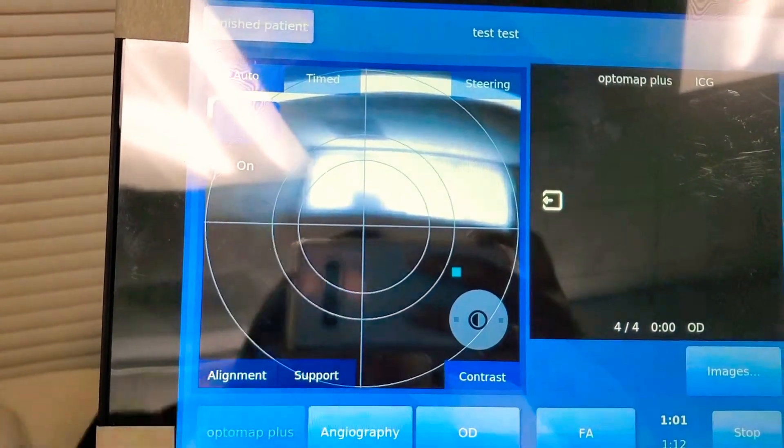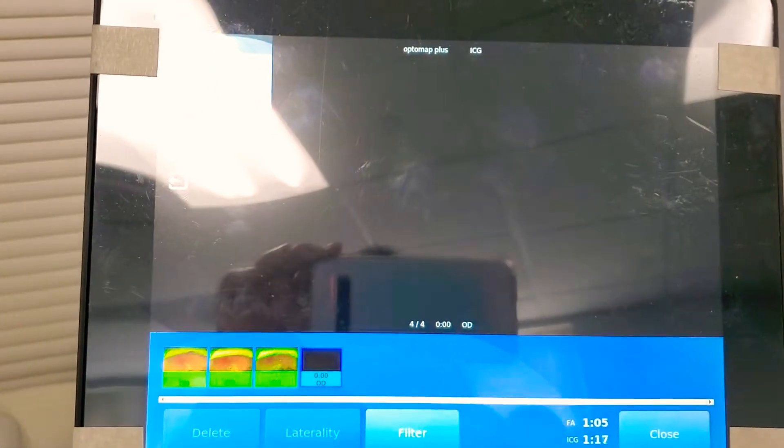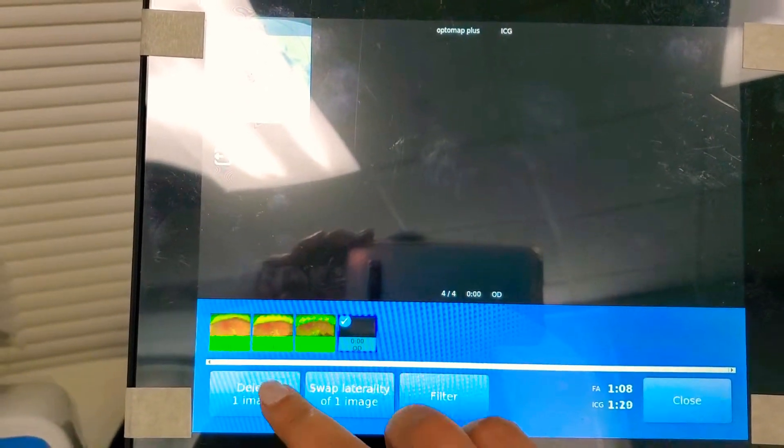Okay. And once we're done. Same thing. We go to images. View the images. We don't like this one. Double click. Delete image.